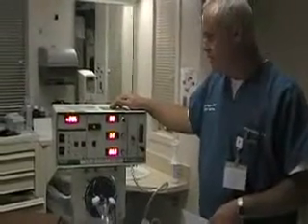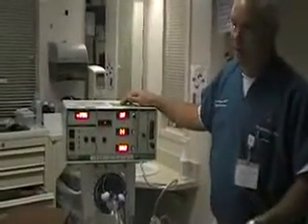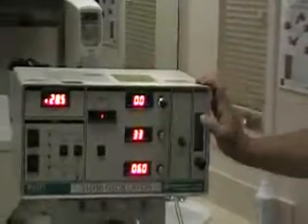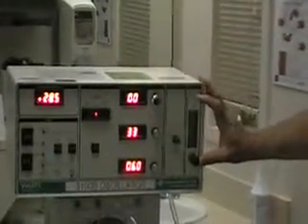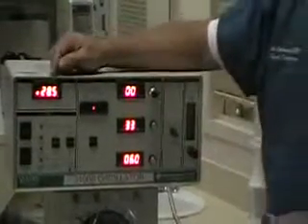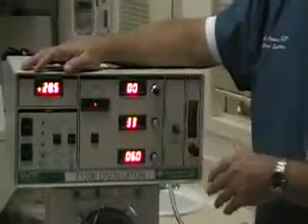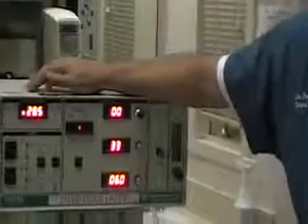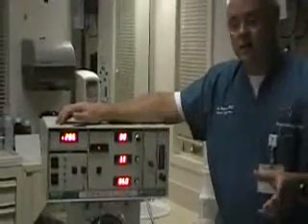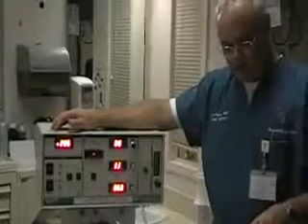What we can do if someone does have a leak in their cuff, and it's something that we can't help and we don't really want, is we can increase our bias flow. That is one thing that we can do to try to counteract a cuff leak. We can go up on our mean a little bit, but if you have a really bad cuff leak, what I've seen as far as our pediatric patients and PICU is concerned, you probably ought to consider changing out the ET tube.